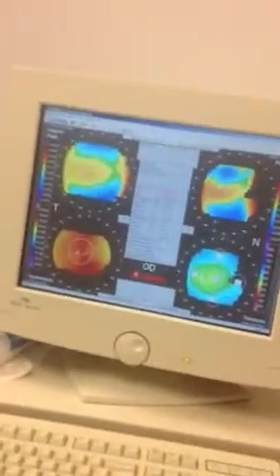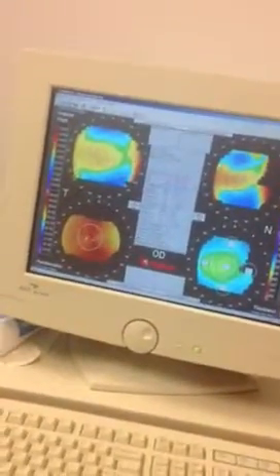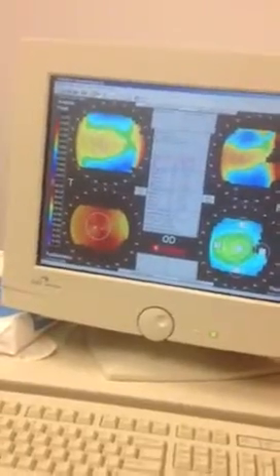When you're looking at the machine, and unfortunately I didn't have 3 hands, so I apologize, it's almost like looking at a Goldman tonometer. So you're going to see the cornea. You'll line the circular reticule up like I showed you to the center of the cornea, but then you've got 2 S-shaped bands that you do have to make them touch just like a Goldman tonometer.